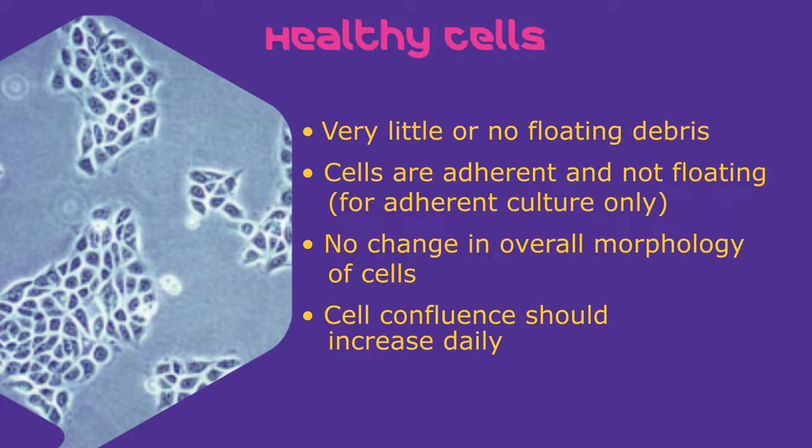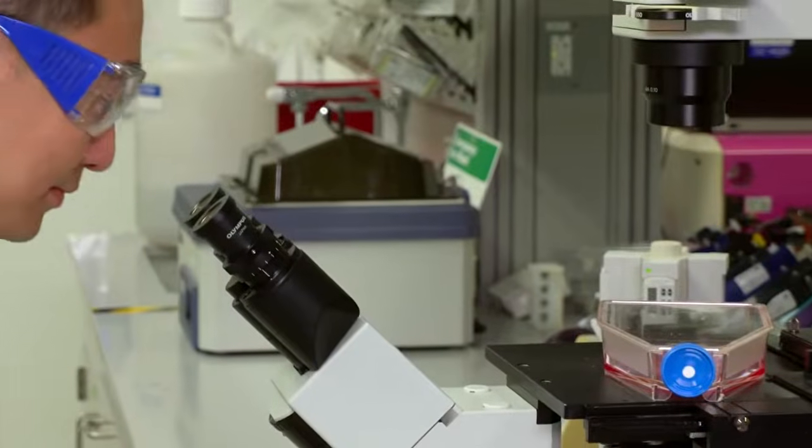Overall, the morphology of the cell should resemble what is indicative of the expected cell lines. Often this information can be found from the vendor website or published papers. Nowadays, we also often use web-based searches to take a quick look at the morphology of the requisite cell types. Now let's talk about the concept of population density.